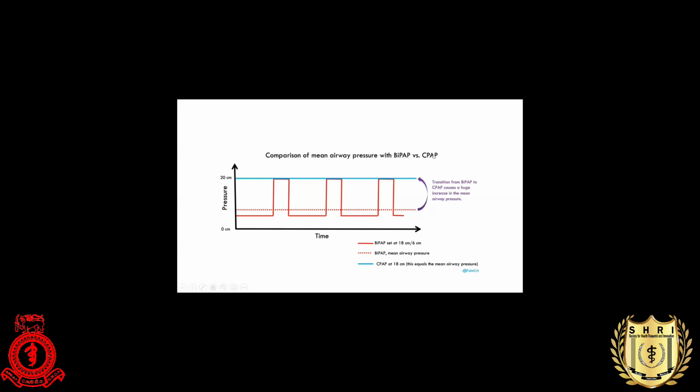And in COVID patients, you know that there is widespread microatelectasis in the lungs. So when you are using CPAP, you can open up these alveoli because it's providing the greatest mean alveolar pressure.